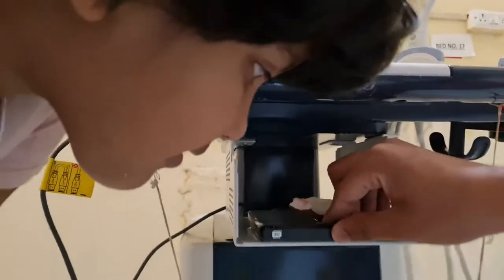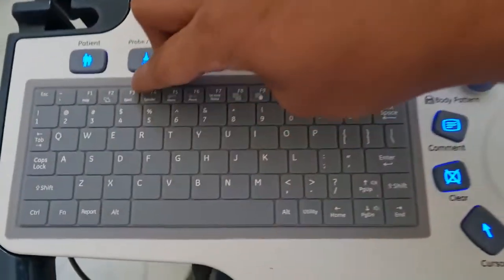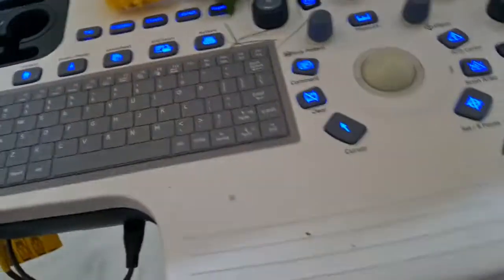Or on the function keyboard, the F3 button is there. F3 button is here. There is also written eject. So you can press it on the screen.